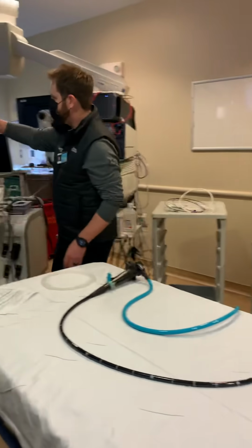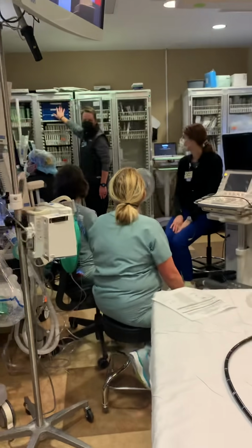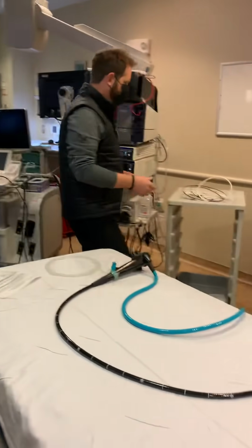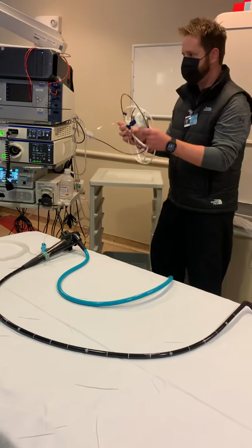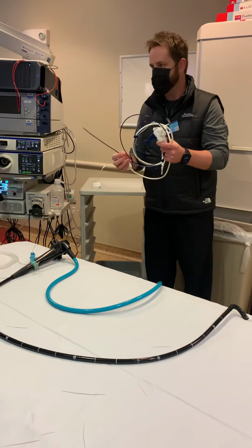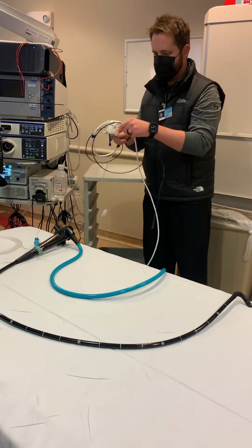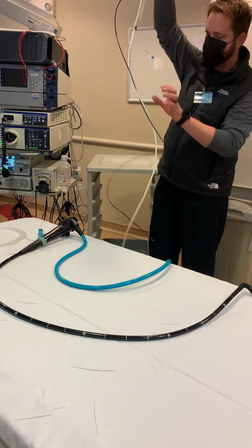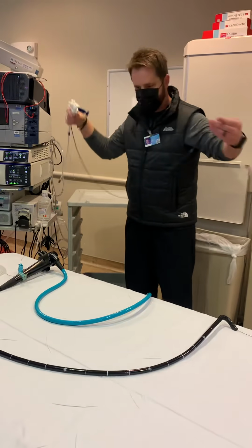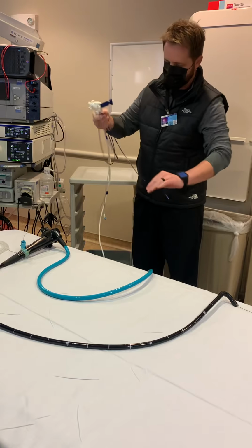The second person is going to come over to the cabinet, grab a box for Spyglass, it's right here. We'll open that box. After you open the box, what you'll find inside is basically this. The only difference is that the blue catheter is actually going to be inside a hula hoop, so it's much more organized than my Spyglass is. What I'll typically do is let the white portion of the catheter fall. This would be in a hula hoop.